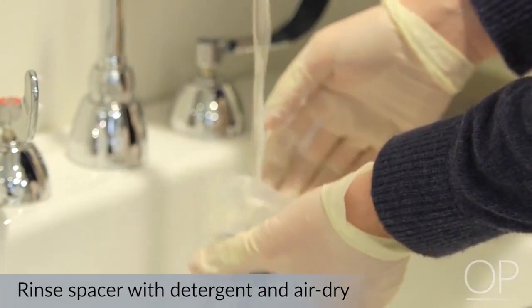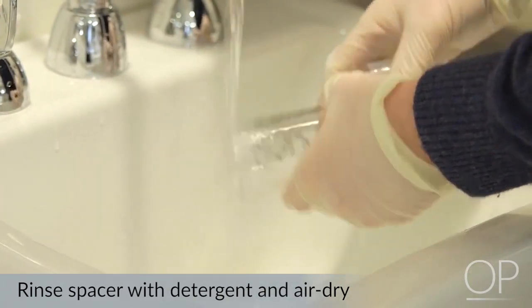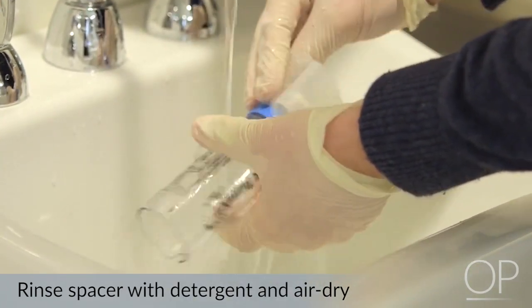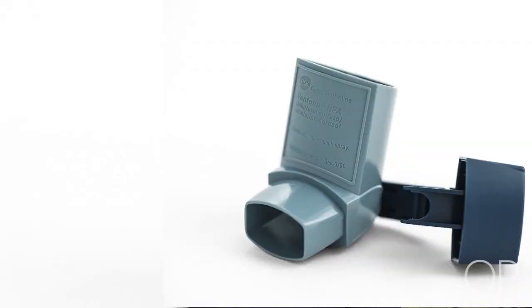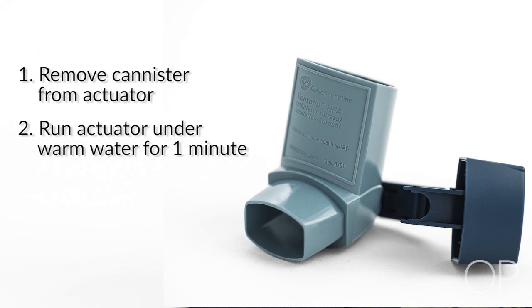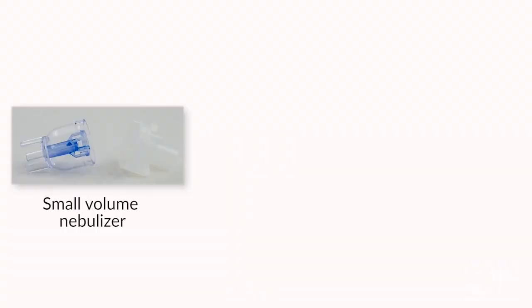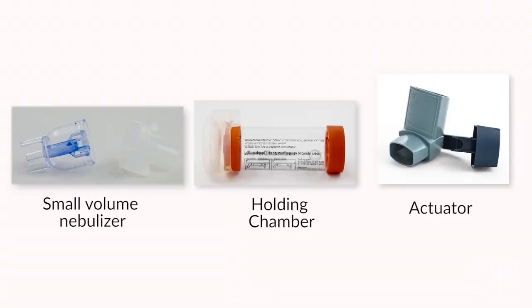Holding chambers should be cleaned with a detergent, rinsed, and allowed to dry. Depending on the specific holding chamber, manufacturer recommendations may vary slightly as to the frequency of cleaning. Recommendations for cleaning an MDI include removing the medication canister from the actuator and running the actuator under warm water for 1 minute, or 30 seconds per end. Importantly, this procedure does not directly disinfect the device. Rather, it cleans the point of contact between the actuator and the canister that can build up with medication and help to ensure proper performance and medication delivery. Small volume nebulizers, holding chambers, and MDI actuators should not be shared between patients.